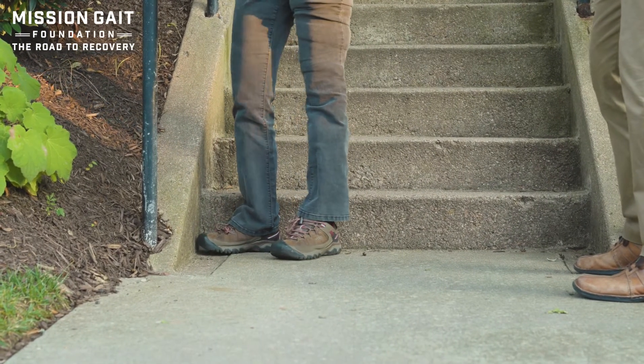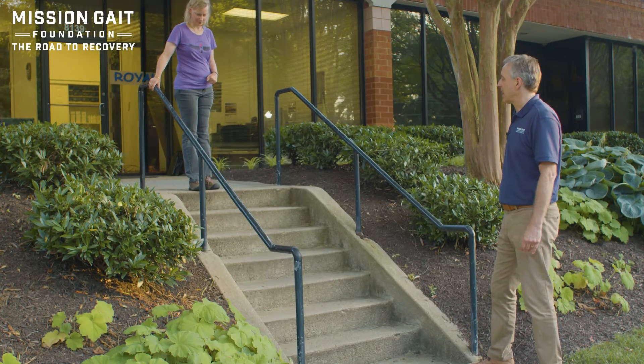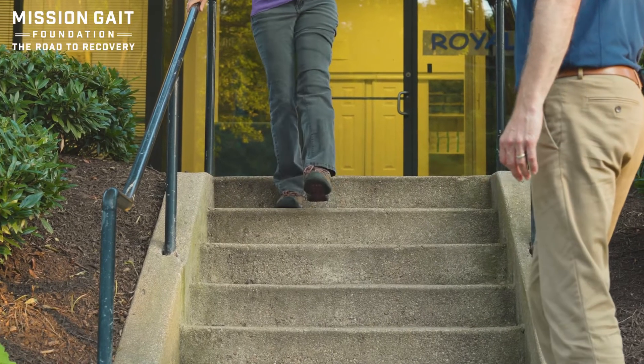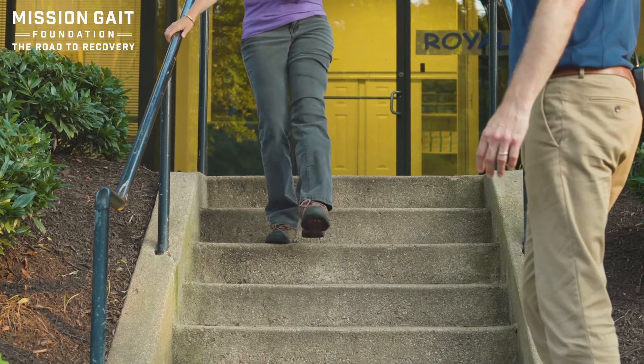And then you would turn and walk away. If you have more confidence and strength, you can come straight down that step, keeping those feet faced straight ahead and loading the heel as you come down to keep the weight back and not get tipped forward down the steps.